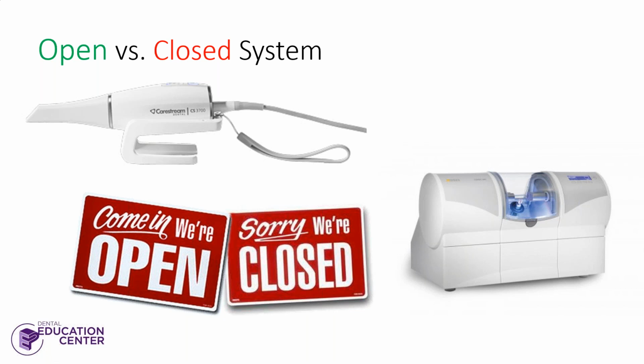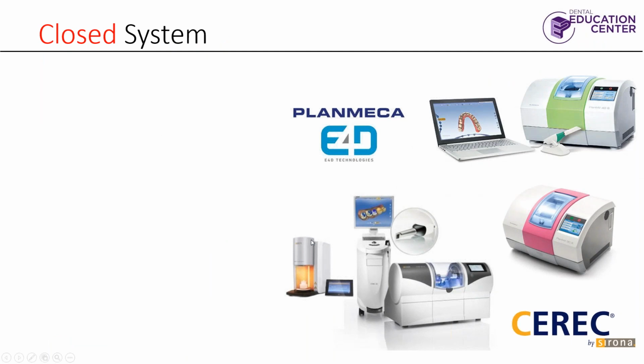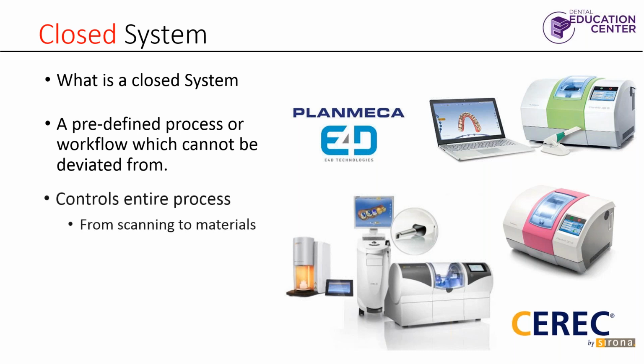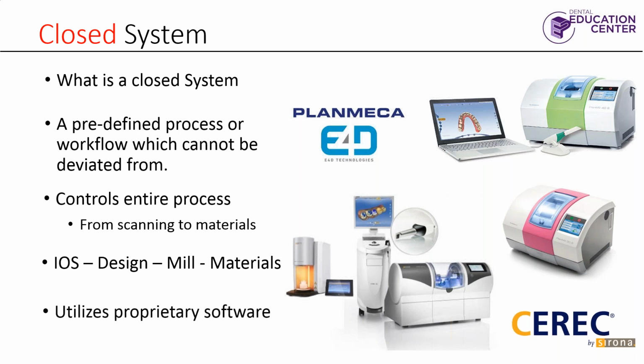What I thought I'd start with was discussing open versus closed systems. We have an open system versus a closed system. These are some of the closed systems on the right. It's typically a predefined process or workflow which cannot be deviated from. What I mean by that is it's defined by the manufacturer. They control the entire process from the intraoral scanner to design to mill. They also control the materials, and it uses their proprietary software.